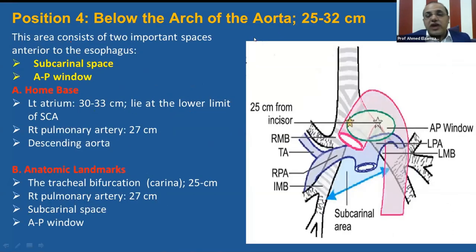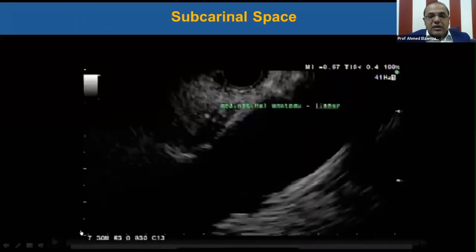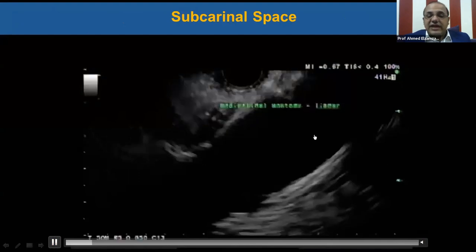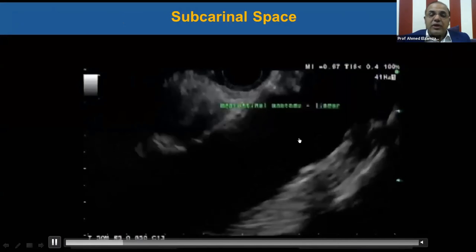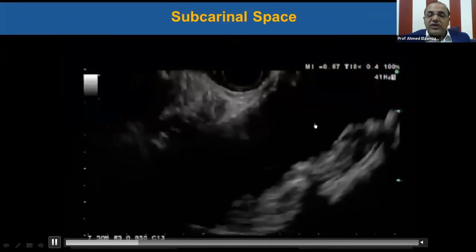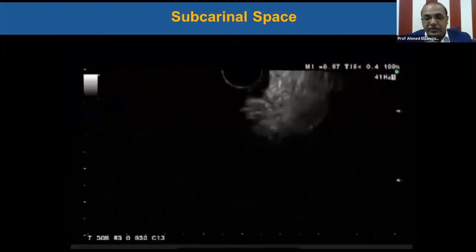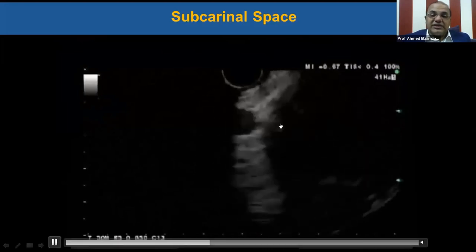Position 4 is below the arch of the aorta, 25 to 32 centimeters, including two important spaces anterior to the esophagus: the subcarinal space and the aortopulmonary window. The subcarinal space can be achieved by tracing the descending aorta from the gastroesophageal junction and withdrawing the echo scope upward, then clockwise or anti-clockwise rotation of 180 degrees to make the probe face anteriorly. We will find a large anechoic structure — difficult to miss — this is the left atrium.